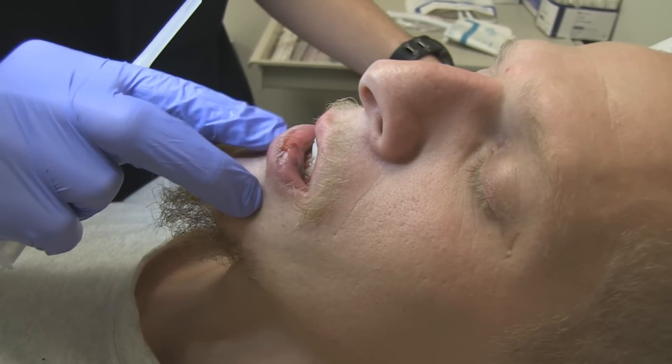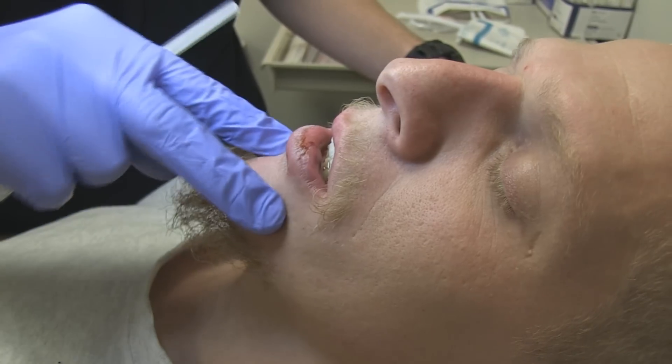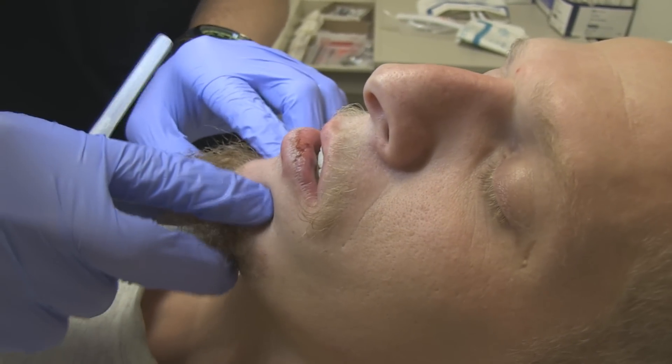Initially, since he has this laceration which is more on the left side, we're going to try doing just the left one. But there are some crossover fibers, so we may need to do both. And here's the approximate position of the mental nerve.